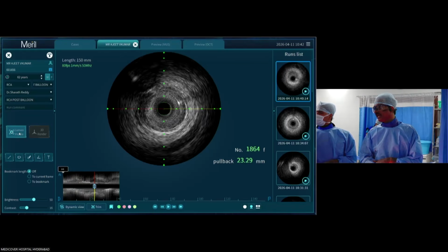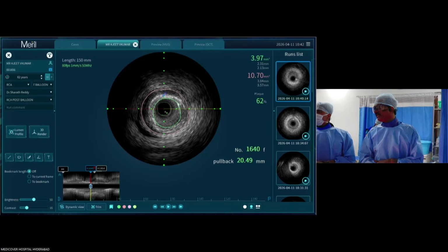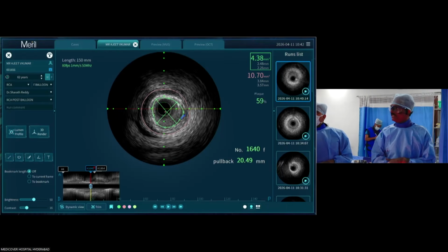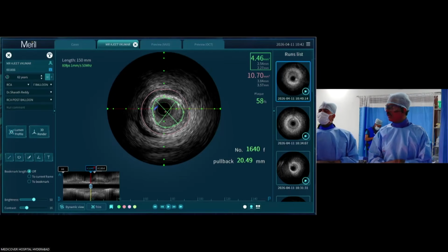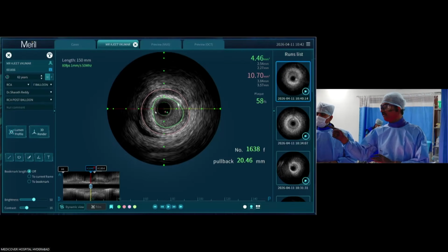This is the proximal cap. So almost 4.5, and you can go a little bit down. So it's nearly 100% lumen area. Just go a little down, distal, measure there. Yeah, here, what's the area? No, I think you can still adjust. See, my residual area stenosis at the site of the lesion, precisely at the proximal cap, which is the hardest part in this patient, is 4.4 against 4.6 of the distal reference.